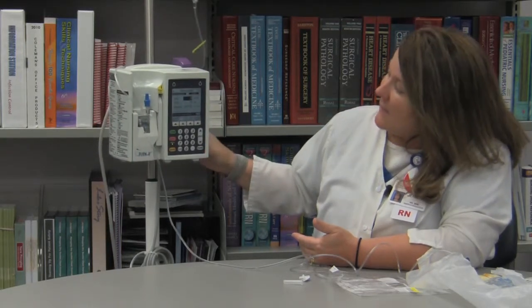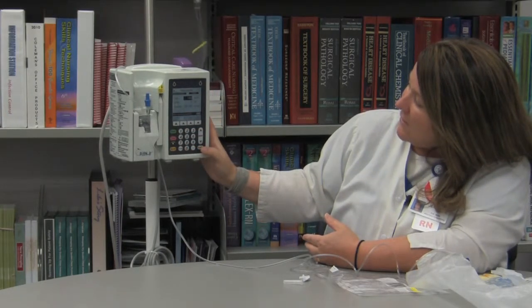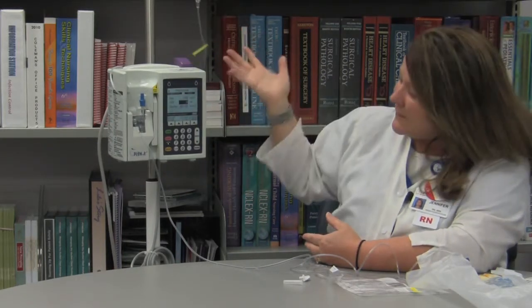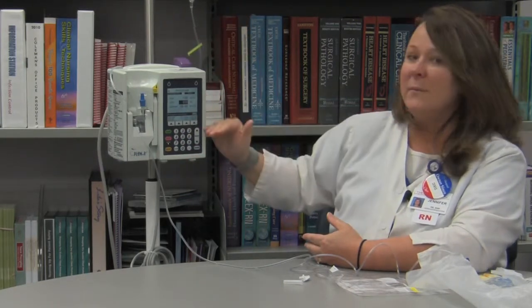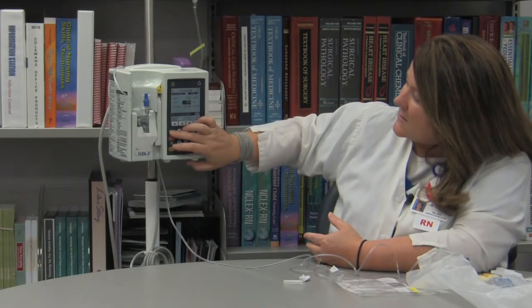The next thing that comes up is my rate. The rate is how fast you're, of course, going to run your IV fluid, and that's going to be dependent upon your physician orders. So if he ordered normal saline at 100, I'm going to put in my rate as 100. My volume to be infused, I just arrow down to that next section. If I hung a liter bag, I would typically put in 975. That gives me a little time when the pump alarms complete for me to get another bag of IV fluid. So I put in 975, then I hit start.